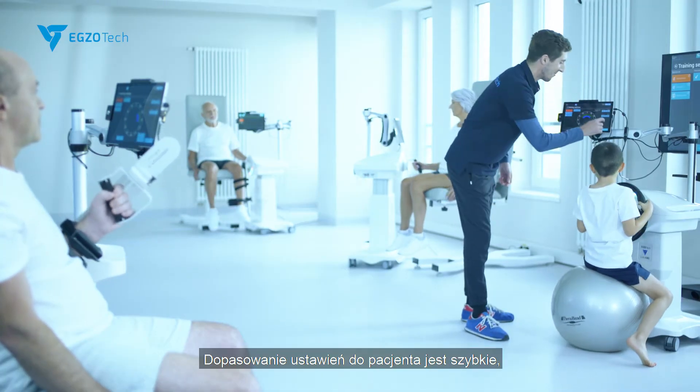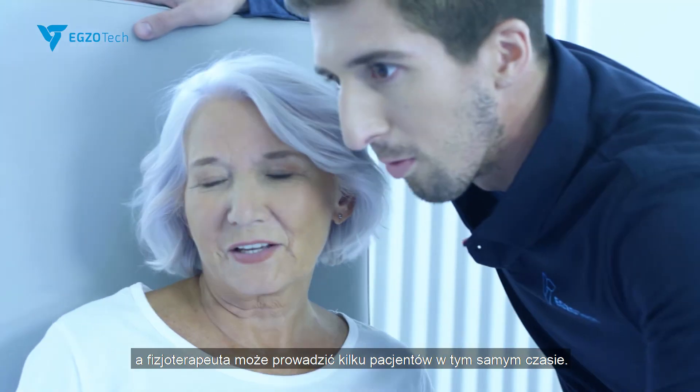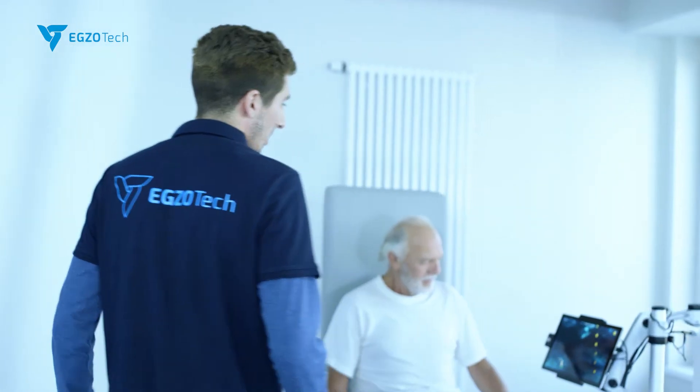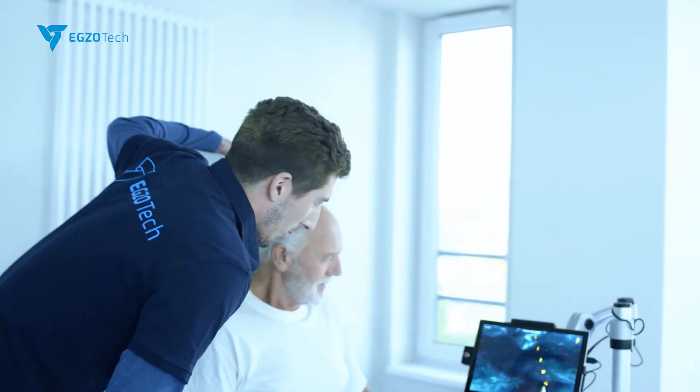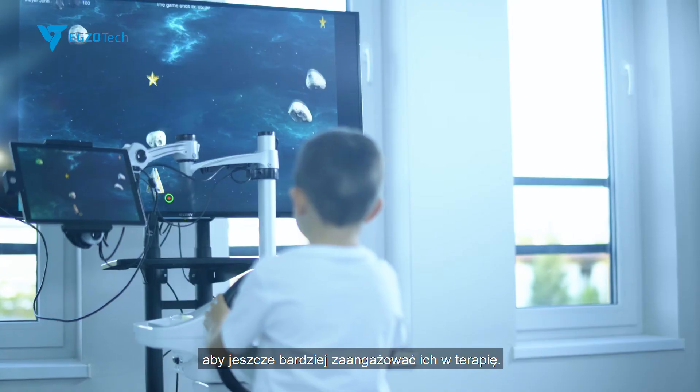The setup of the patient is quick, and the physiotherapist can work with multiple patients at the same time. We can work with our patients using games to engage the patient even more.